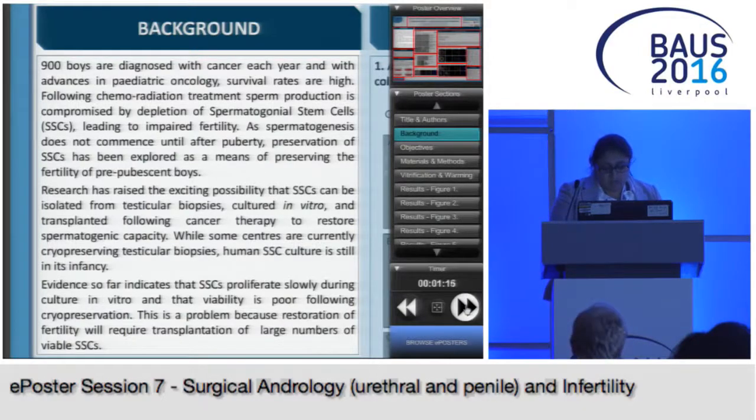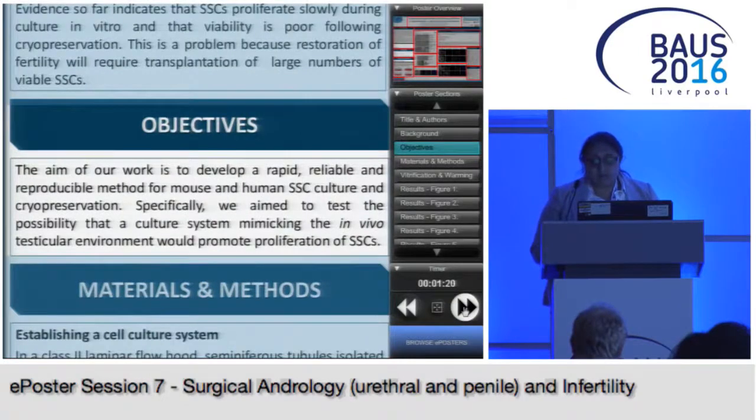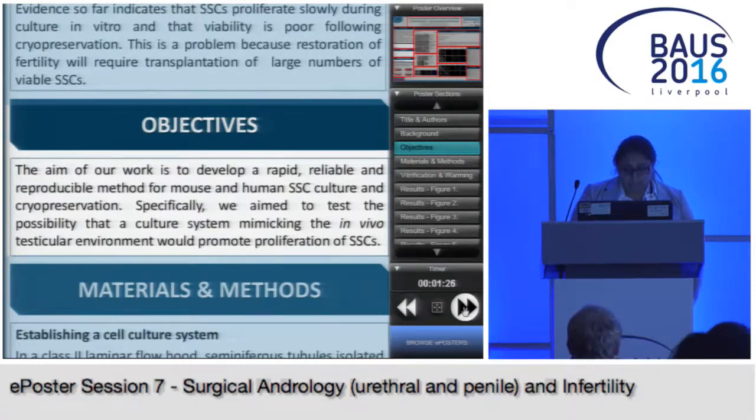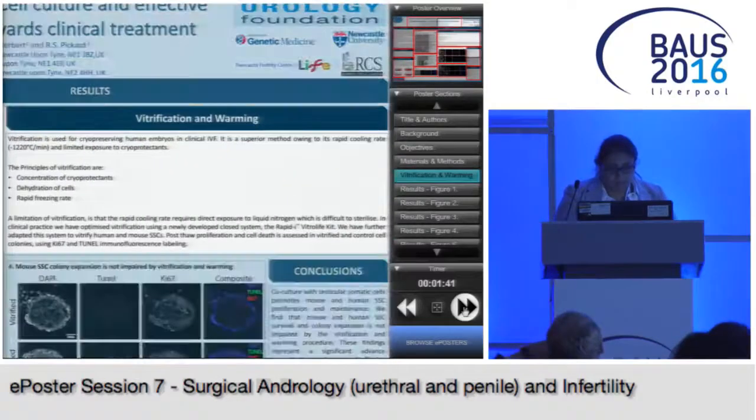So the aim of my study was to work out a rapid, reliable, and reproducible method of culturing these cells, and also a way of storing them effectively. I used mouse tissue from day 6 mice, which are around the prepubertal age, and also testicular tissue from men undergoing surgical sperm retrieval to do my experiments.